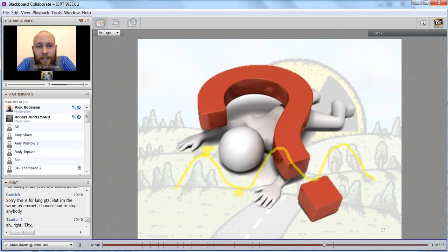I know that in some departments we were expecting a 600 dose rate, and due to the fact that their treatment times tended to be 20 seconds, interrupt, breathe, 20 seconds, and so forth, the dose rates were only getting up to about 400 at the very peak. So it'd be interesting to see the comparison: yes, we've produced this plan, and we've managed to reduce heart volume and lung volume. However, is this actually a true reflection of what is occurring with our patients?